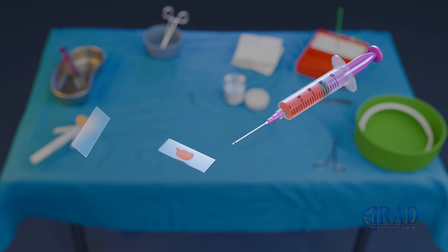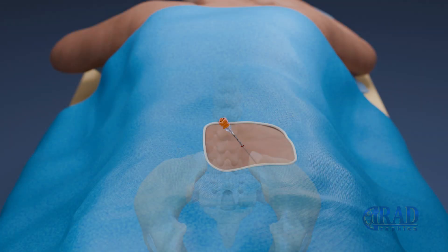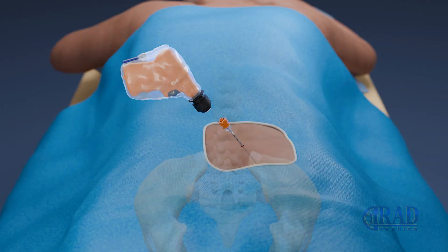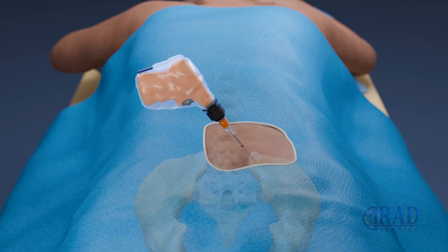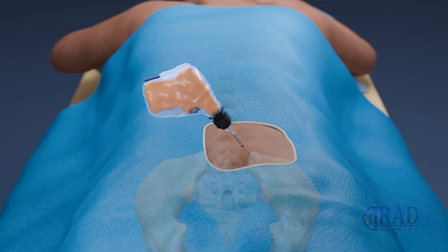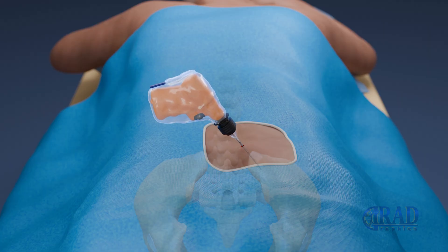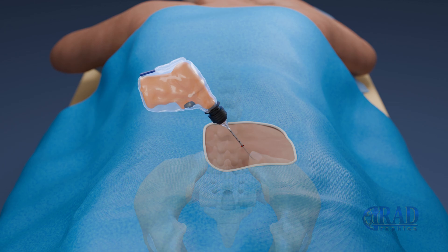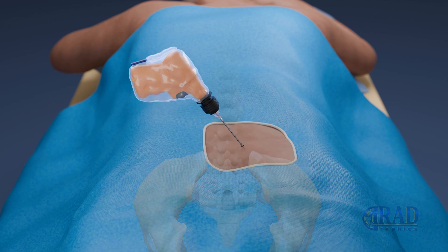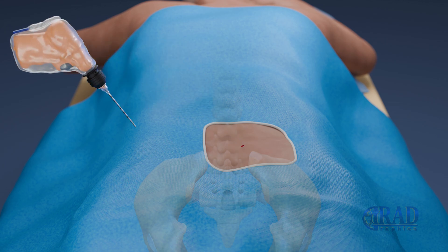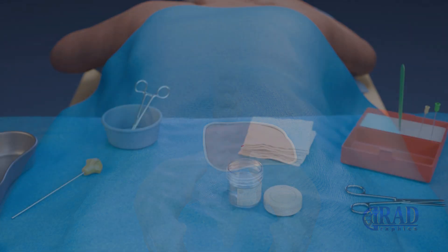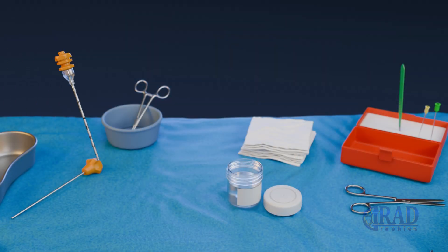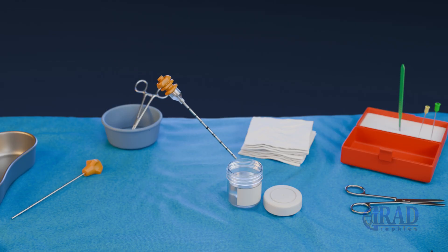Once the aspiration is complete, the outer biopsy needle is advanced further to obtain a core sample of solid marrow, which is then carefully removed and placed in a specimen container for pathology analysis.